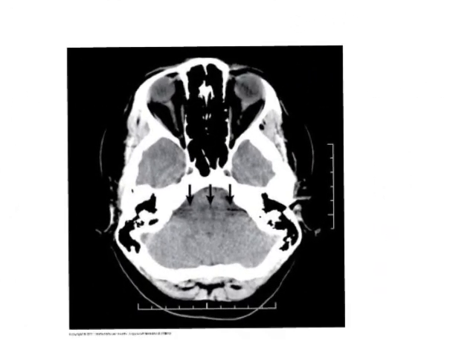I kind of alluded to this when I talked about the arms. This is a beam hardening artifact. I think our textbook talks about beam hardening. So what happened? Well, I think about this being like the Klondike bar, right? Or like the polar bear eating the people inside of the igloo, right? It's crunchy on the outside, but soft on the inside, right? With the Klondike bar.